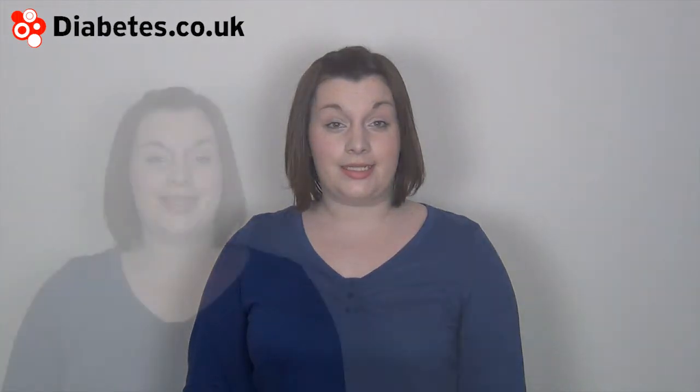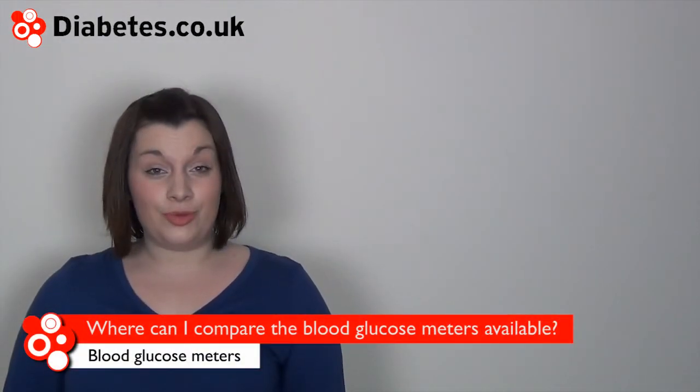Blood glucose meters need to be able to provide an error in readings of less than 20%. Diabetes.co.uk has reviews for all the main blood glucose meters available. We also have meter giveaways on the site, so you could pick up a new blood glucose meter.